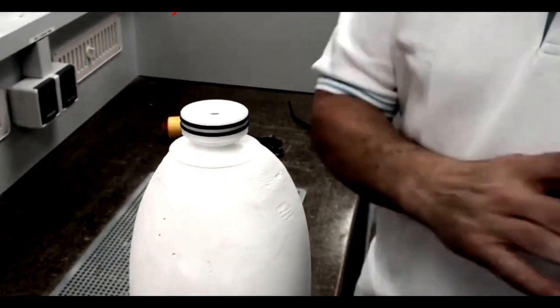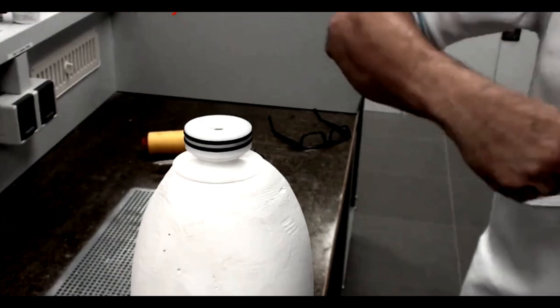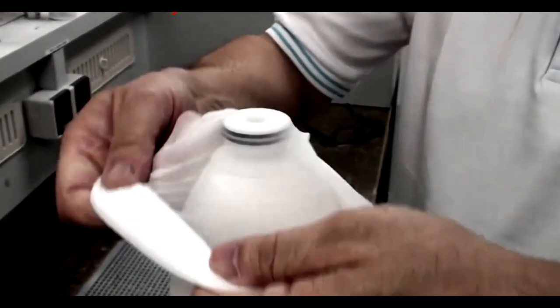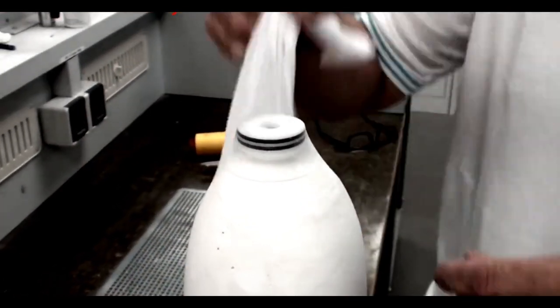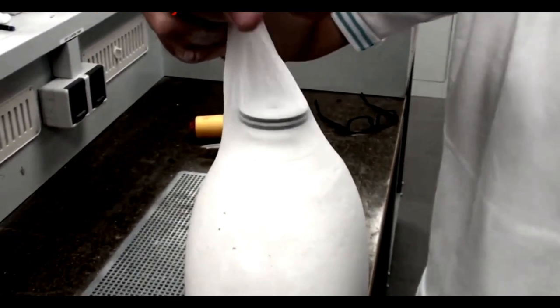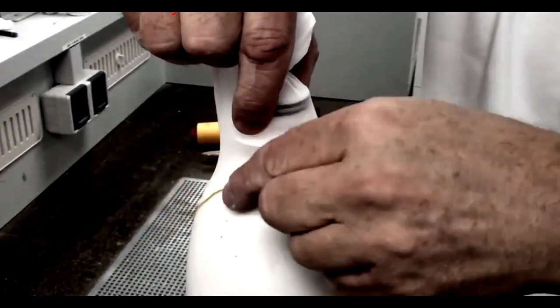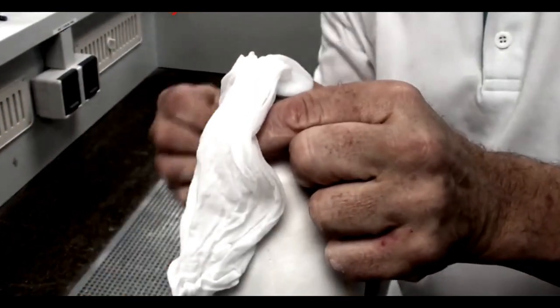At this point take nylon stockinette and put it over the top of the positive model and the lamination dummy. And take a small thread and tie off the nylon stockinette underneath the lamination dummy and around the screw.